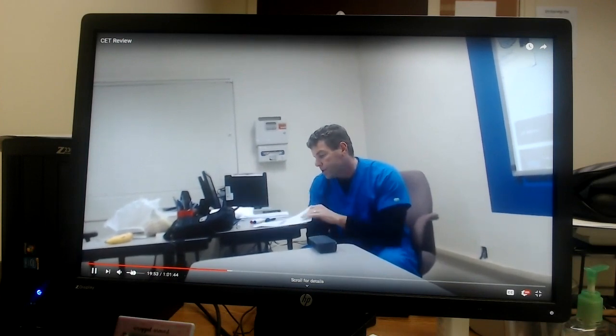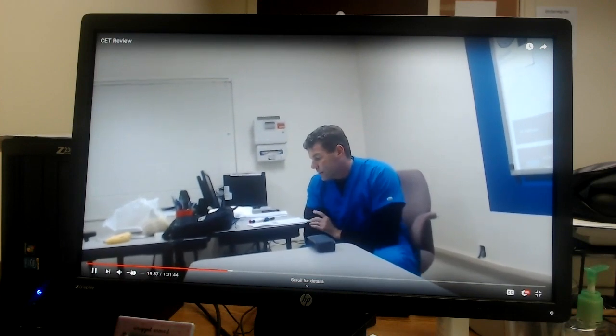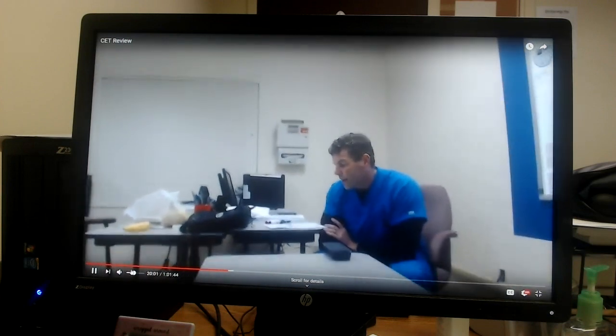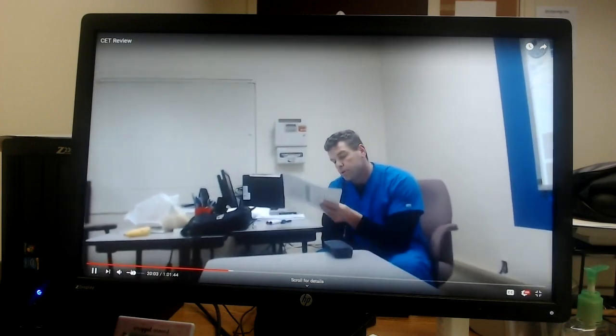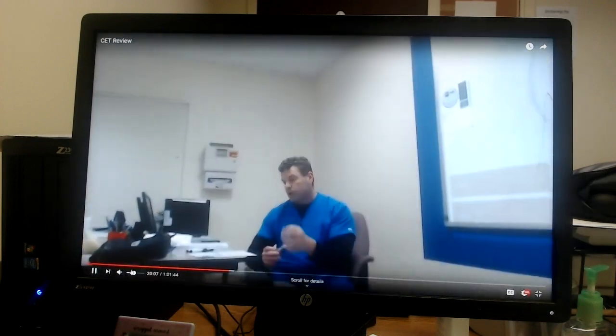Indicates an understanding of the teaching. I'll leave the monitor on while I sleep. I think that's the best one, because you can't remove the monitor while you shower, and I can't walk, no, you want to do your normal stuff. I should avoid caffeine while being monitored. Maybe probably one of the best parts of your normal.